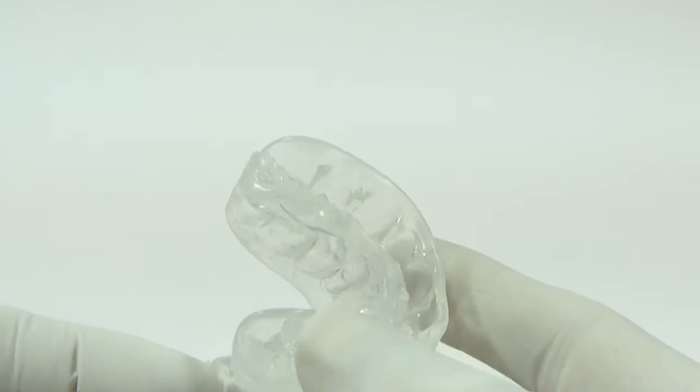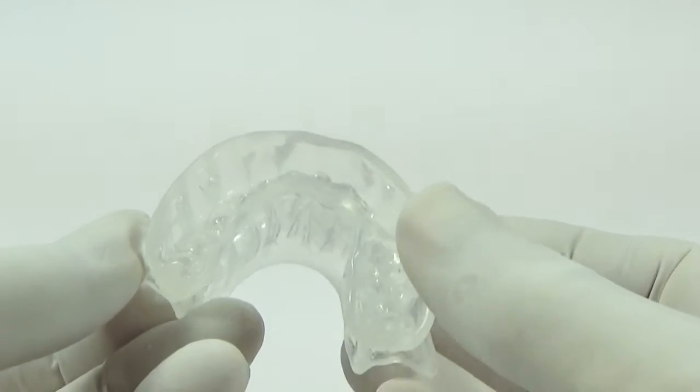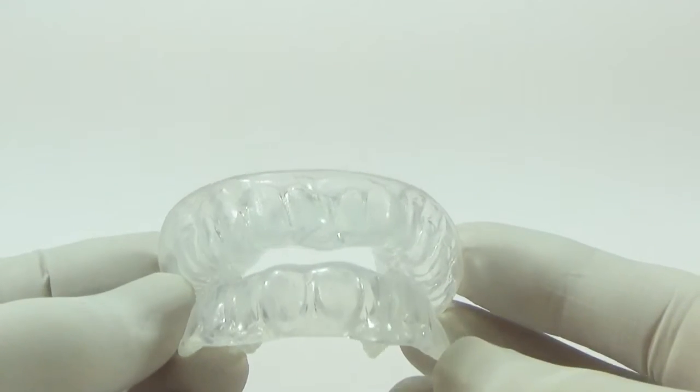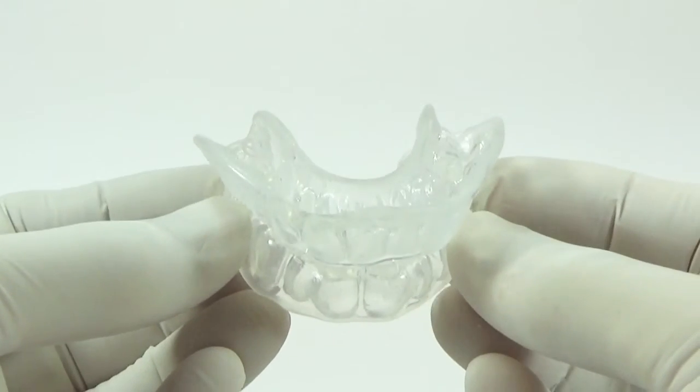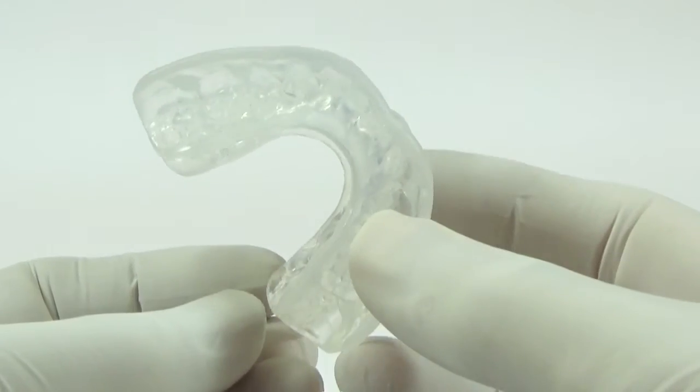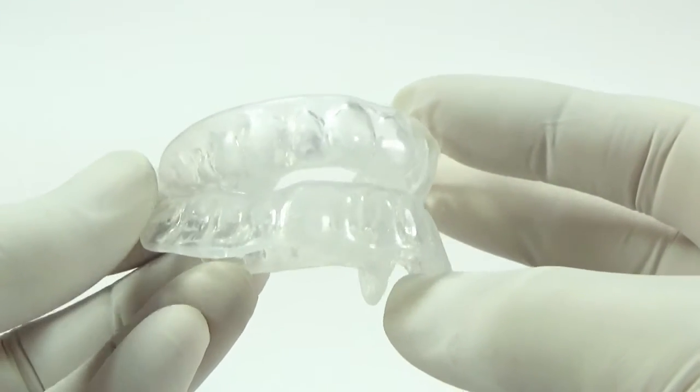This overcomes a problem with all generic mandibular advancement devices — they are usually one size fits most people. This usually results in the mouthpiece feeling either a little bit too lumpy and thick, or even too small and not giving enough support if you've got a particularly large mouth.